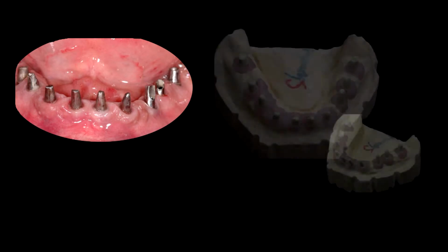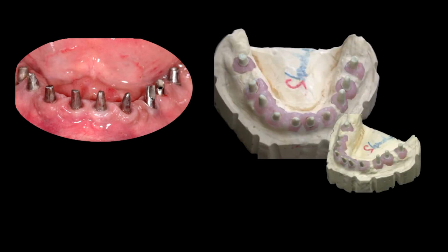This, in turn, allows final installation of original abutments in the oral cavity without the need of their subsequent removal, and to use their duplicates, not original abutments, to continue the restoration. The merits and usefulness of analog LA and the methods of duplication with its application are difficult to overestimate.